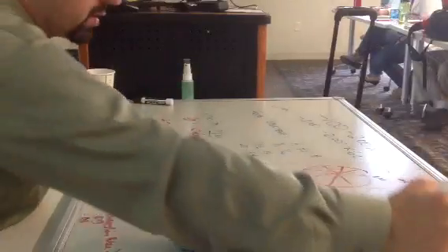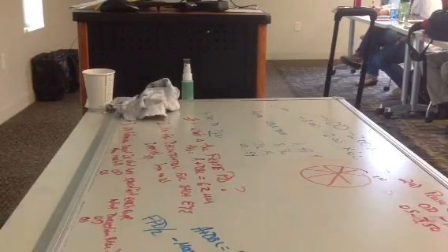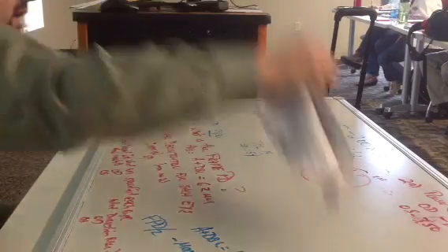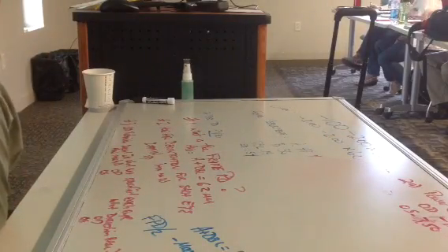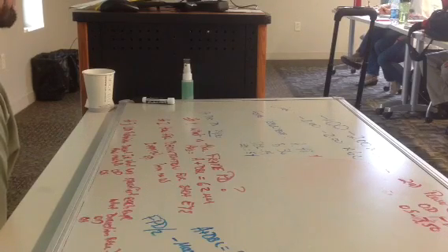So here's your power at 180 in the OD, power in the left eye, OS at 180. So now, if we decentered it properly, and we put the lenses in front of where they're supposed to be, the right eye is looking through the optical center, the left eye is looking through the optical center, the amount of prism would be none. They're looking right where they need to look.